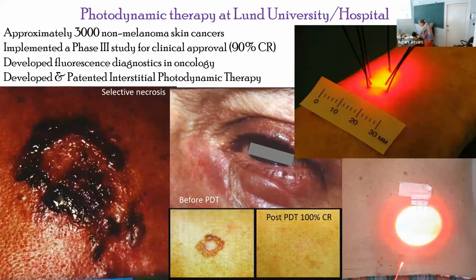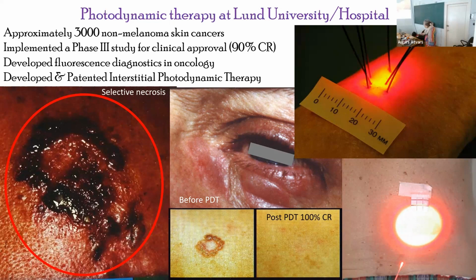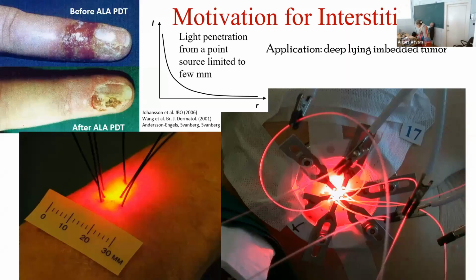So approximately 3,000 patients were treated together with a colleague at the oncology and dermatology department at Lund University. And we could find that we had a 90% complete response, which is quite good. And we also, of course, developed the diagnostics in conjunction with this. But of course, there is always two sides of a coin, and we'll touch upon this. There you see, by the way, that we illuminated the whole area and still we got only necrotic formation in the area which was sensitized.